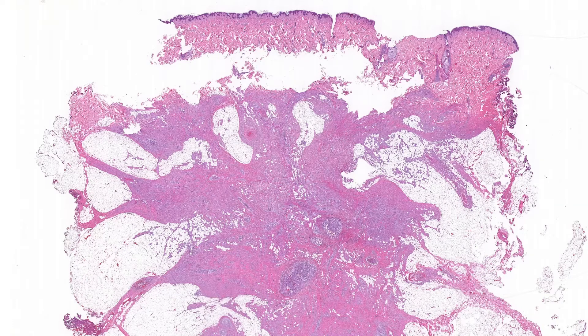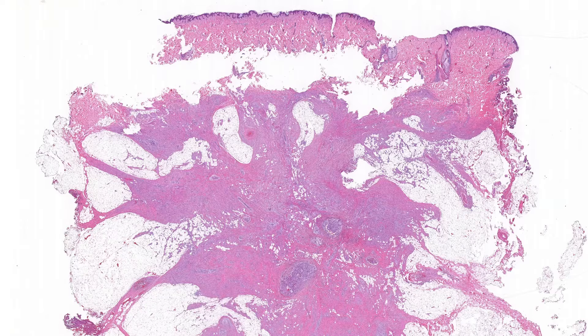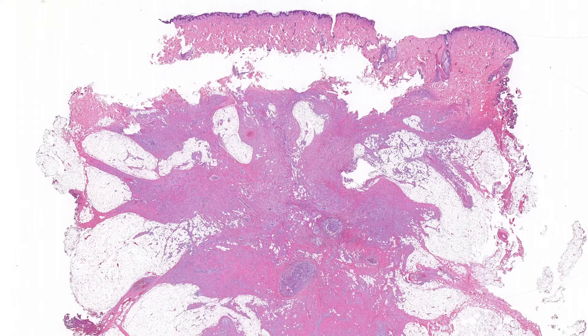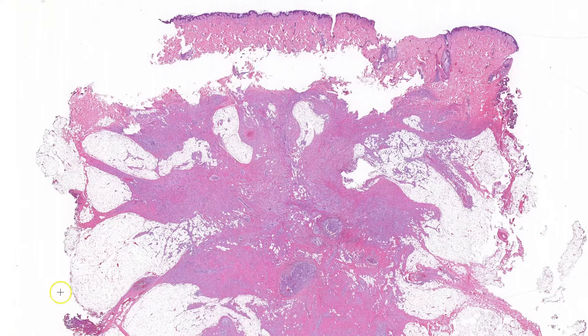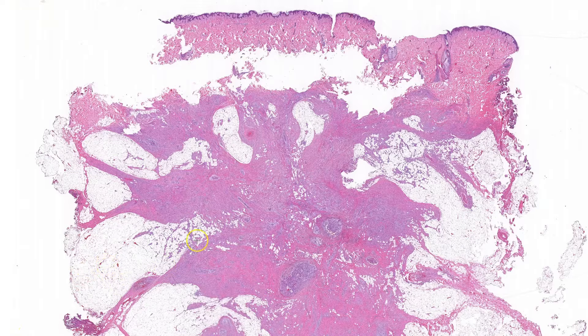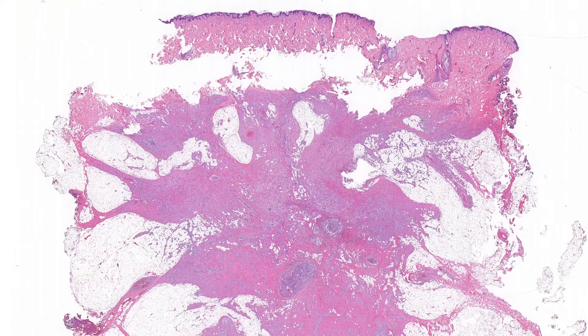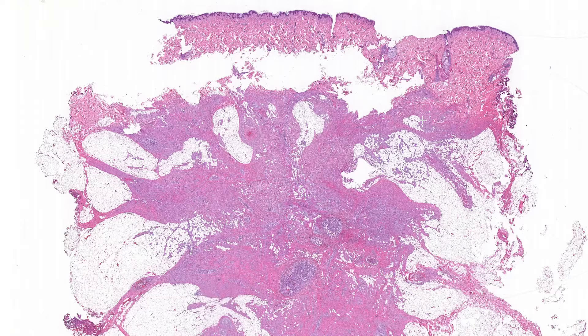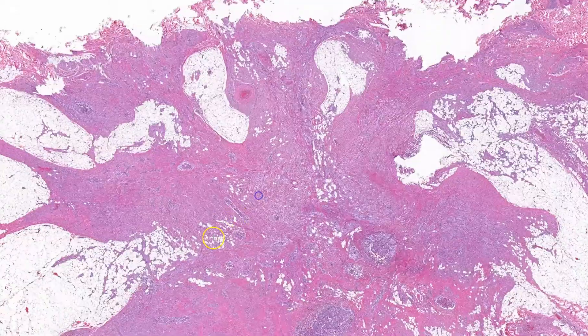This is an excision of a plaque-like lesion on the back of a 16-year-old female. At low power, we have an infiltrative mass located in the subcutis with focal extension into the dermis. If we take a closer look, we can see that there are two distinct and mixed components within the lesion.